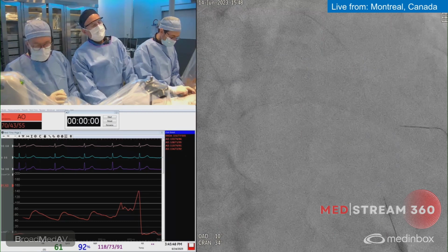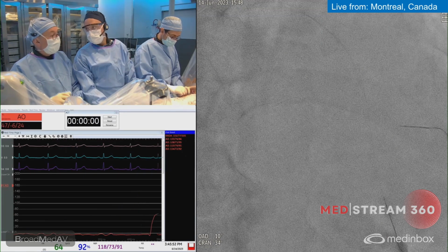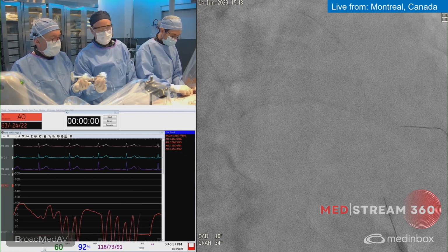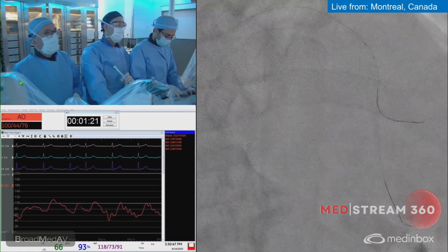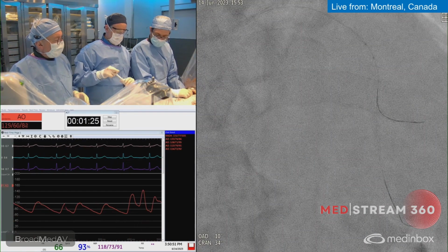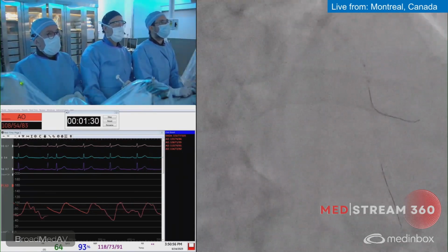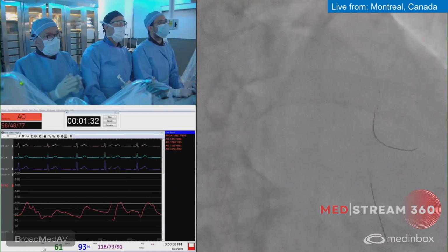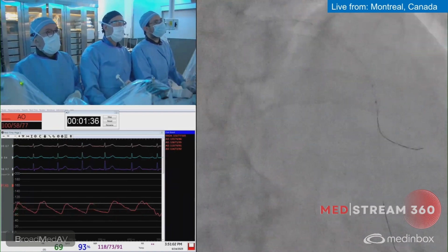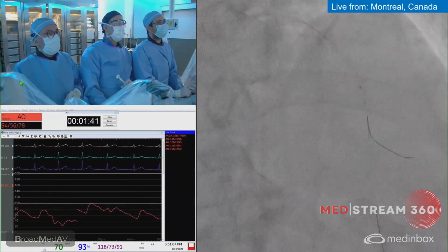So clearly here we have a complex PCI according to, there was a lot of criteria for that definition. Yes. I mean, a lot of criteria to define a complex PCI. Are you negative on this, or could you put neutral sometimes? Neutral helps. I feel that, again, it's not a long balloon, but the non-compliant, when you put negative, becomes very stiff. If you put them neutral, at some point, I felt that sometimes they can make a difference to deliver. I'm not sure in this case, but sometimes I do that.